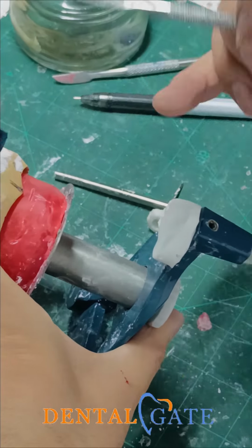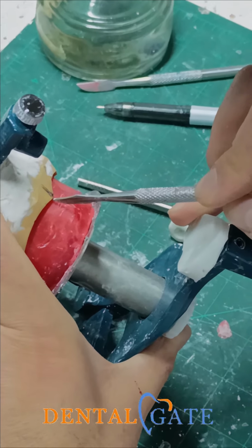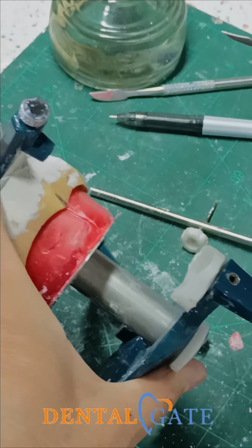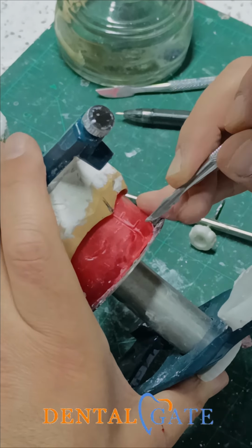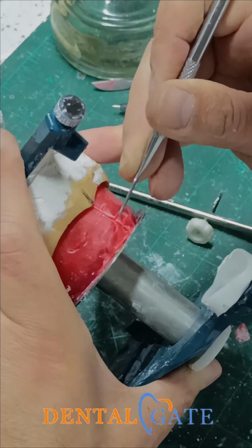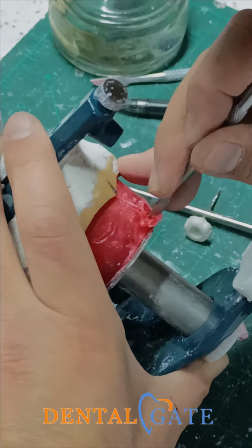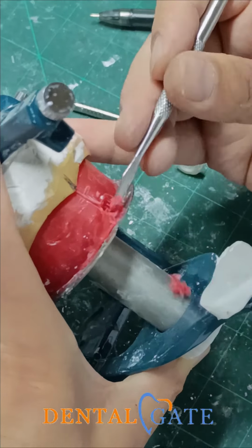So regarding the midline, I can transfer it from the patient's mouth, but there is no patient mouth now. We will totally depend upon the incisive papilla. So what I can do now is remove one segment of wax to provide sufficient space for the central incisor, okay? But don't remove all the wax, because the wax will support it and make the arrangement more visible.